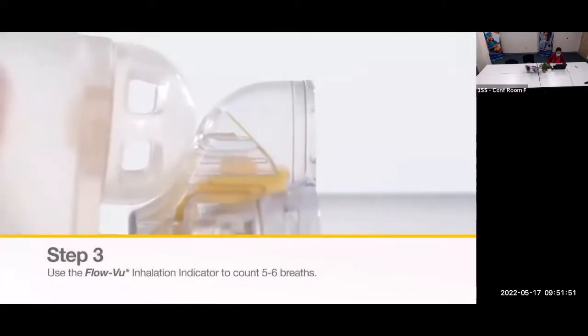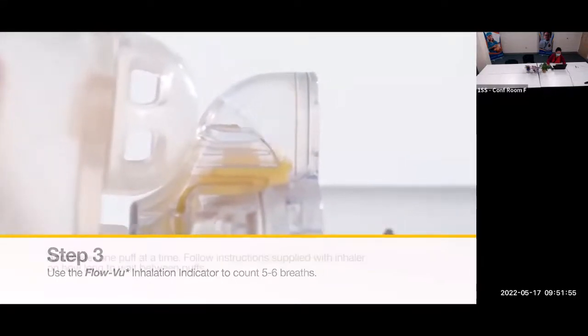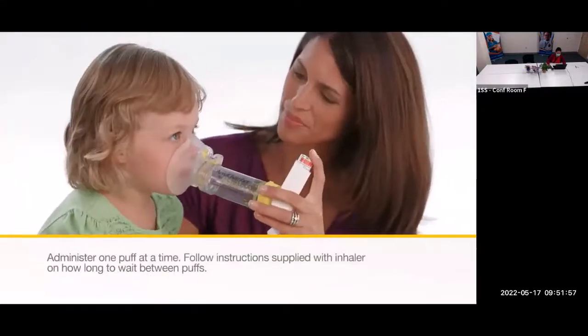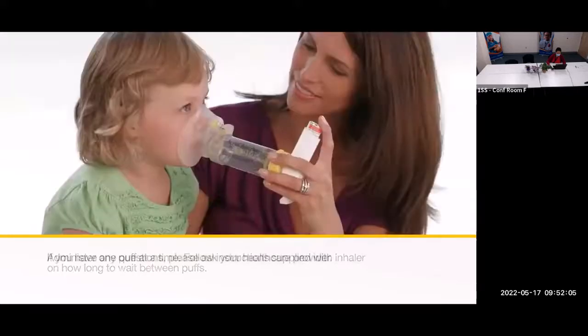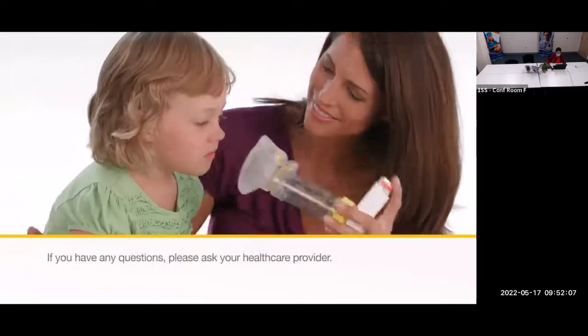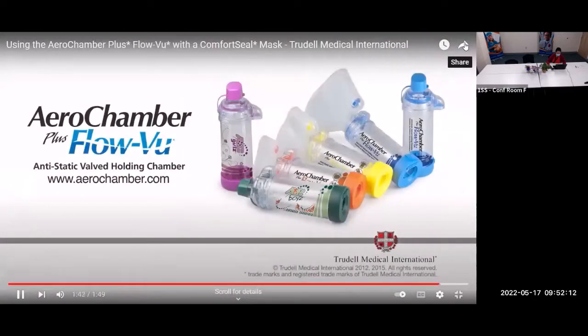It often takes multiple breaths for a child to inhale the medicine from the chamber. Only administer one puff at a time, following the instructions supplied with the inhaler on how long to wait between puffs. If you have any questions, please ask your healthcare provider. For complete instructions, please refer to the patient instructions available on our website.